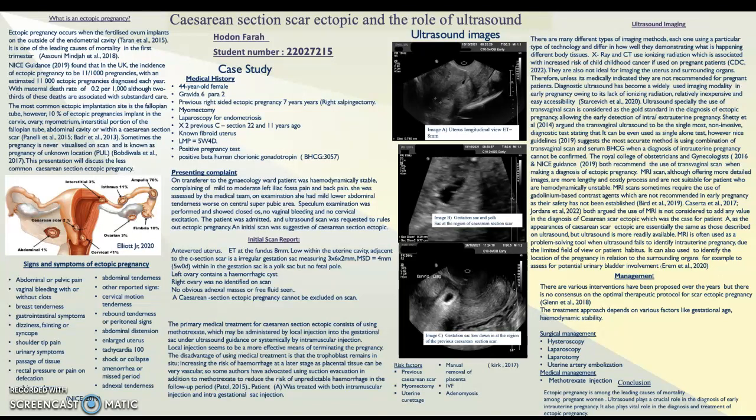Ensure to check the patient's full name and date of birth before explaining the procedure to the patient. Chaperone must be offered and documented in the report as per NICE guidelines.